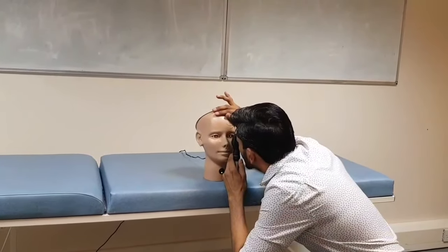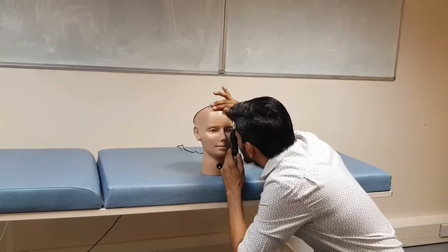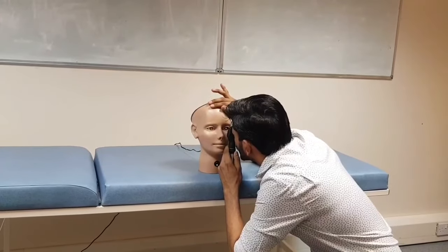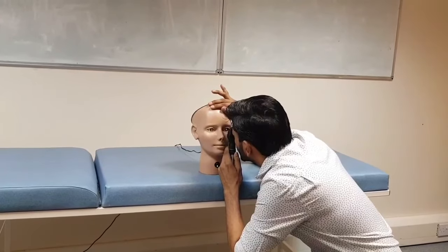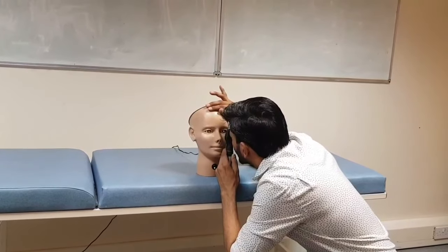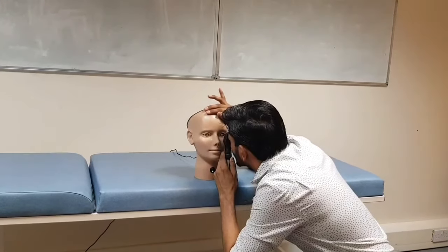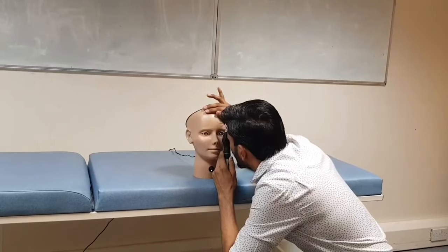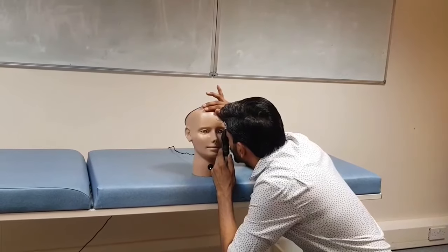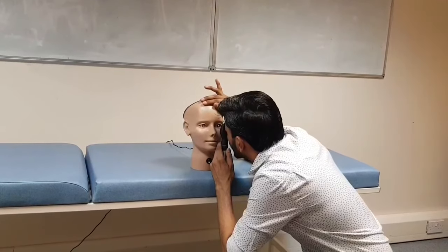I can see the optic disc, which is pinkish-yellowish in color. Optic disc cup ratio is normal. I can see the vessels originating from the disc — they are normal in caliber and not tortuous. Macula seems to be healthy. My most probable diagnosis is normal fundus.